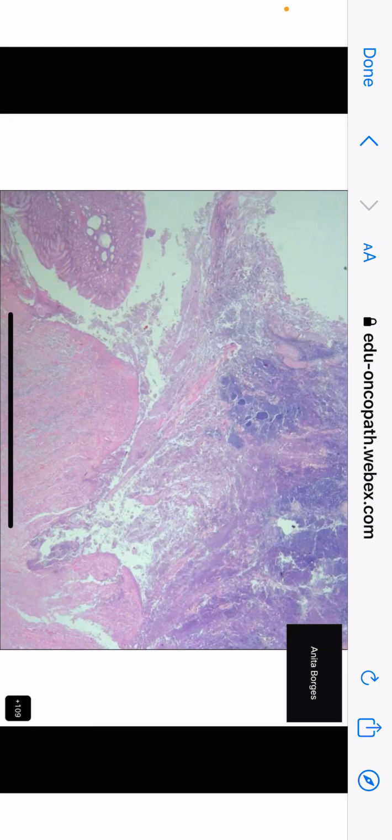Yes or no? There is an apt word to be used over here. It is devitalized tissue. All necrotic tissue is devitalized, but we normally use the word necrosis, and we understand this. This thing is not only devitalized, but it has lots of these small little blue areas, as you said, which are probably colonies of some sort, right? So it is devitalized tissue which seems to be colonized by organisms.